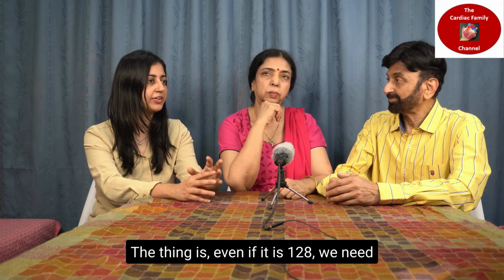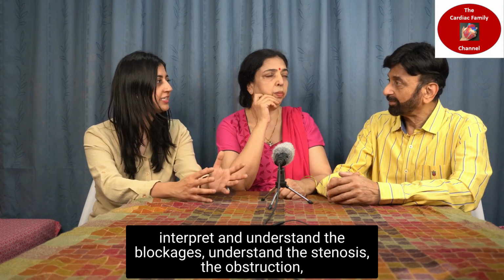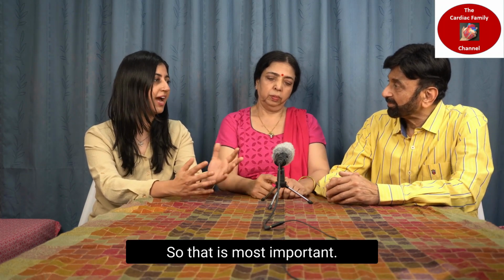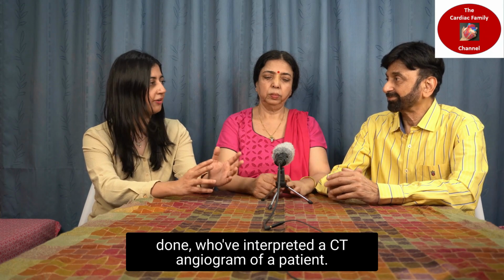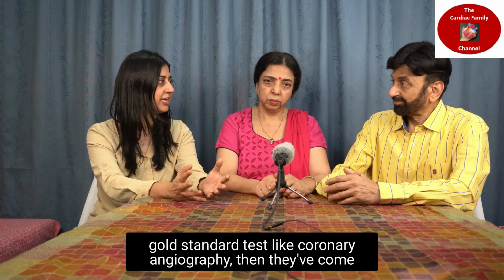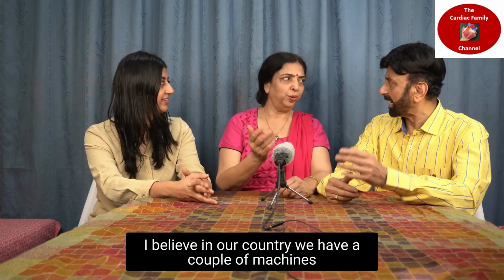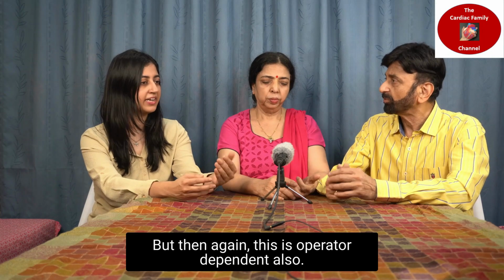The thing is, even if it is 128, we need an operator, that is a radiologist, who is able to interpret and understand the blockages, understand the stenosis, the obstruction, and correlate it with the patient's symptoms. So that is most important. We have had radiologists who've interpreted a CT angiogram of a patient, and if that patient has been subjected to a gold standard test like coronary angiography, then they've come to the cath lab and seen whether their interpretation was correct or not. It matches or not. I believe in our country we have a couple of machines of 512 which is supposed to be matching very much. It matches well, but then again this is operator dependent also.